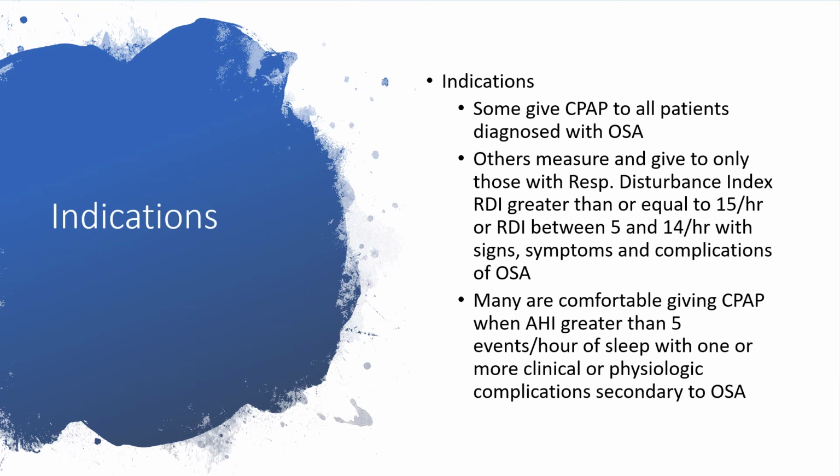What are the indications for positive airway pressure? Some give continuous positive airway pressure to all patients diagnosed with obstructive sleep apnea. I have no objection.